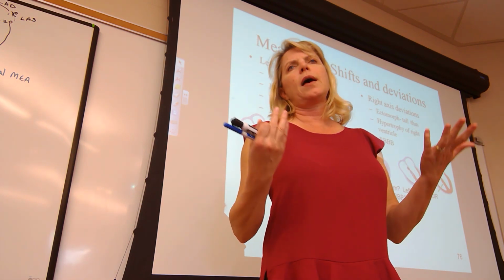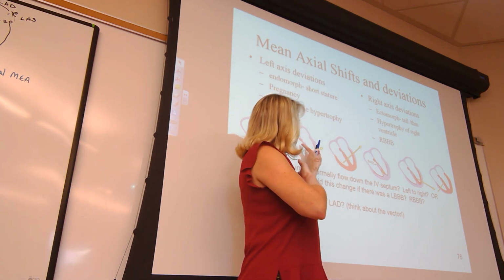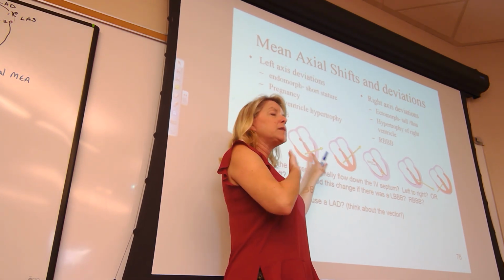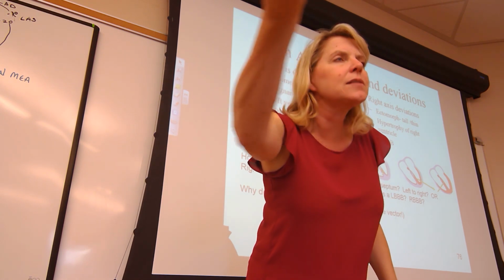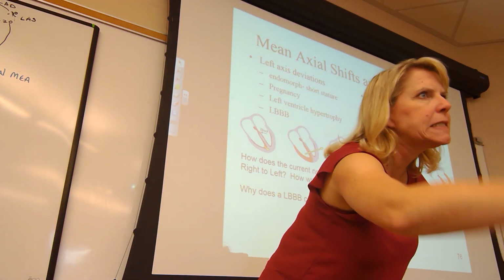Beyond normal, reasonable expectations. A left bundle branch block, shown over here, means the right side of the IV septum will depolarize ahead of the left. That's not normal. I ask questions on this.